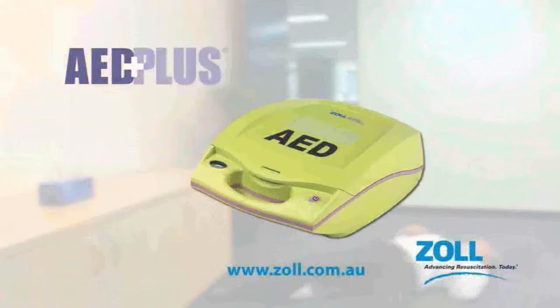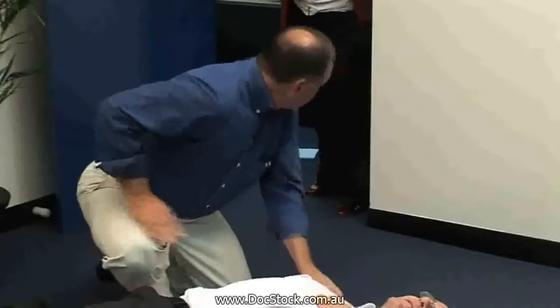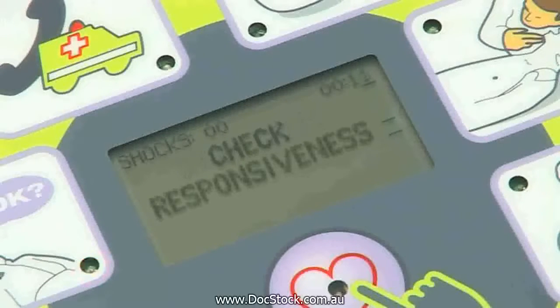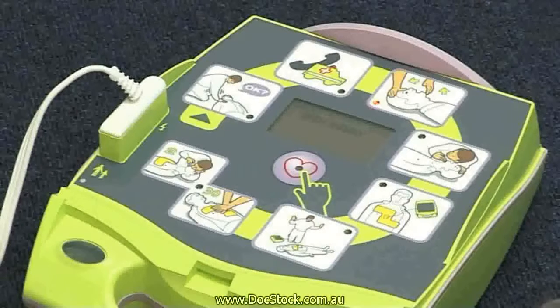The Zoll AED Plus provides a step-by-step process to help you provide life-saving care during sudden cardiac arrests. Every second counts, so your understanding of the following procedures can save someone's life. The AED Plus unit provides voice prompts, text information, and visual indicators to help you perform the correct action at the right time.